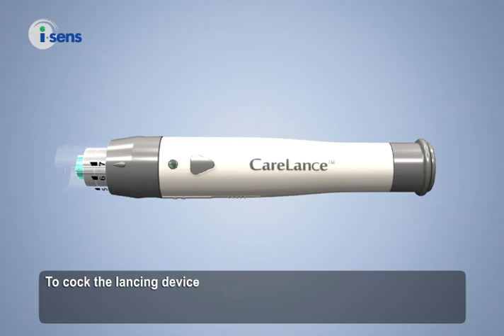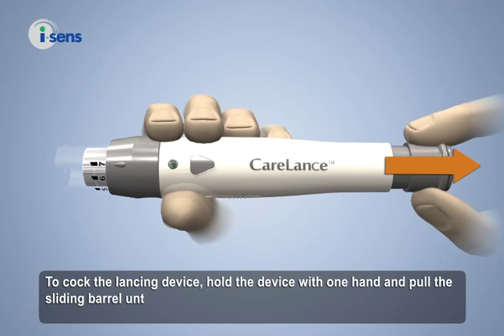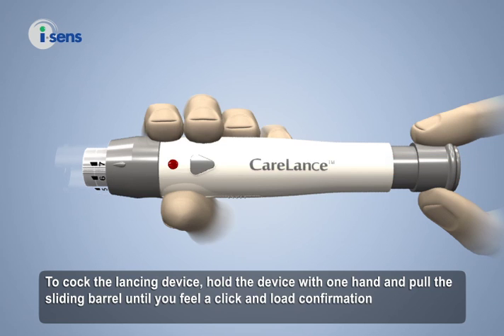To cock the lancing device, hold the device with one hand and pull the sliding barrel until you feel a click and the load confirmation window turns red.